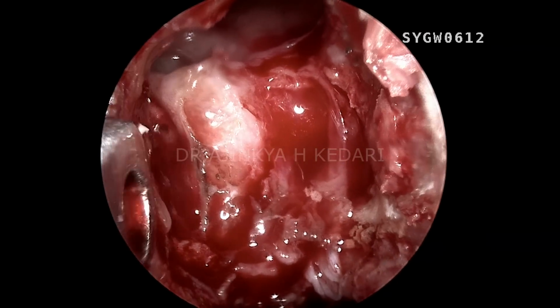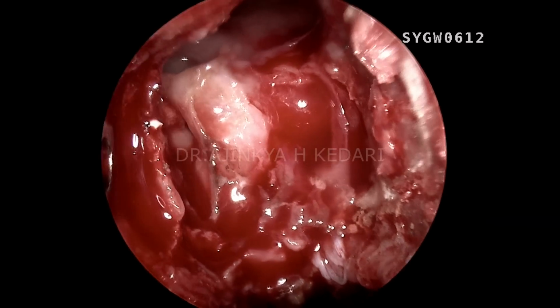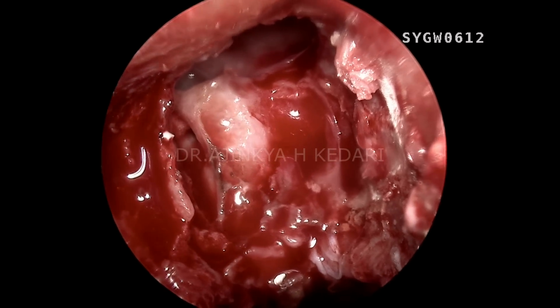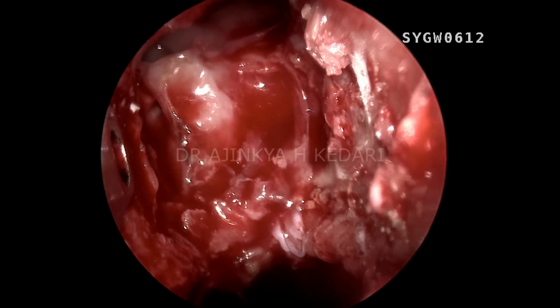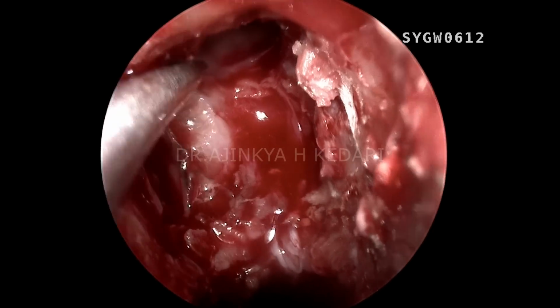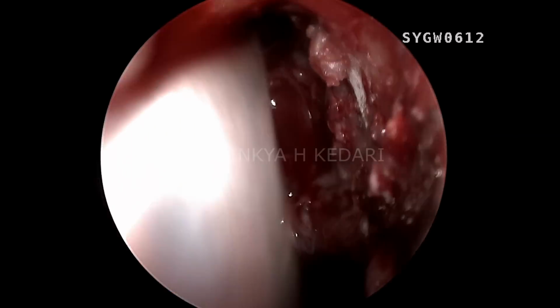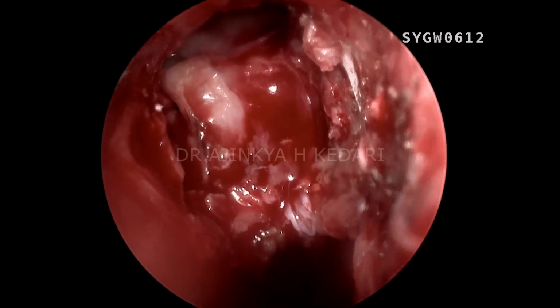You can see there's a small bony plate exactly at my Freer's suction right now. There's a small bony plate you will be seeing. If I happen to drill that as well, I'll have a further direct approach to my defect as such. So you can see that's a huge opening. That's a huge exposure I've done on the patient's right side, unilateral extended Draf.